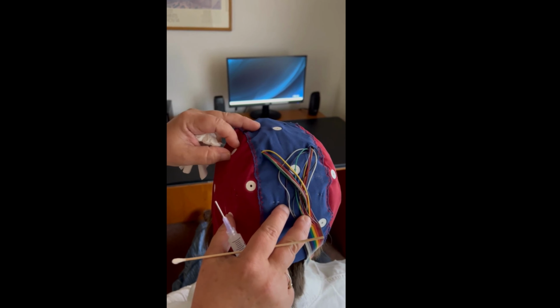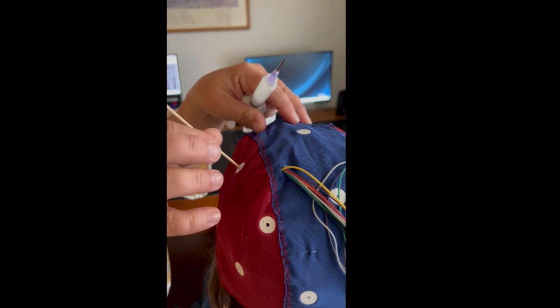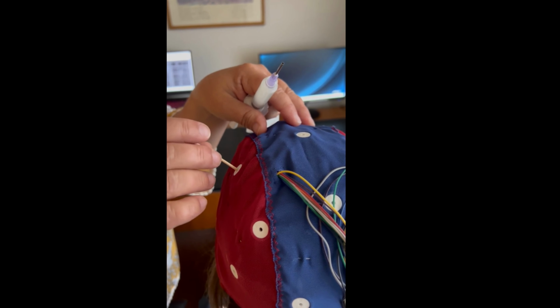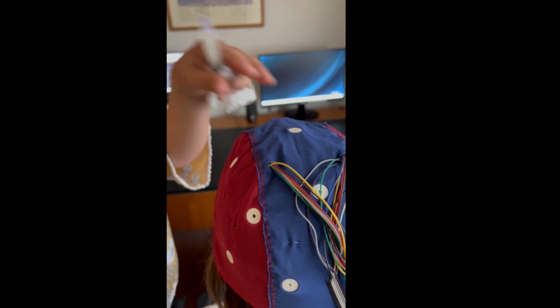And now we're going to use our Q-tip. And you just want to put it right there and just kind of twist it back and forth. Maybe rock it back and forth inside to move the hair around. Now we're at 6.4. We're still at an acceptable level of impedance, but for training purposes, we're going to work to get that under 5.